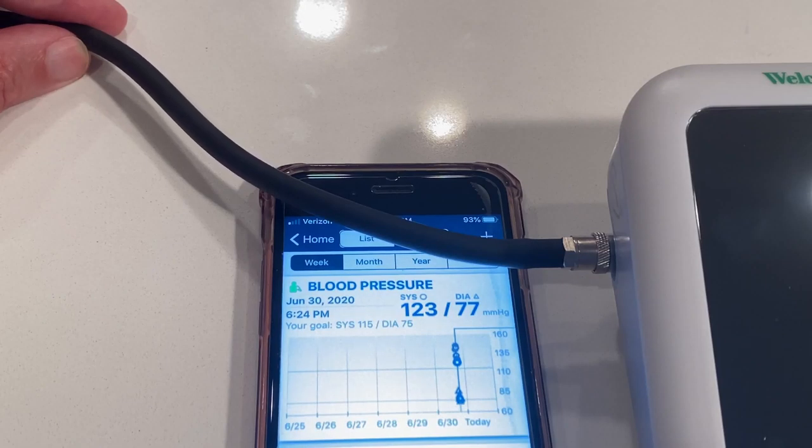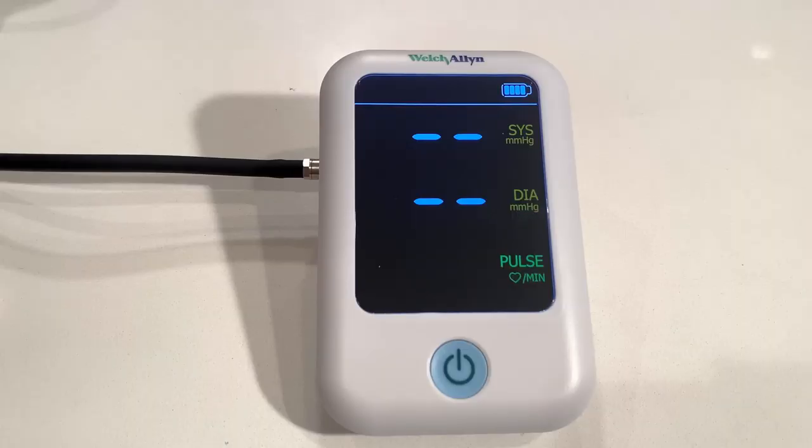The cuff inflation feels very comfortable, and I'm not the only one saying that — when you read the reviews, it doesn't squeeze your arm as bad as other monitors. And it only took 20 seconds to measure, which is faster than most.